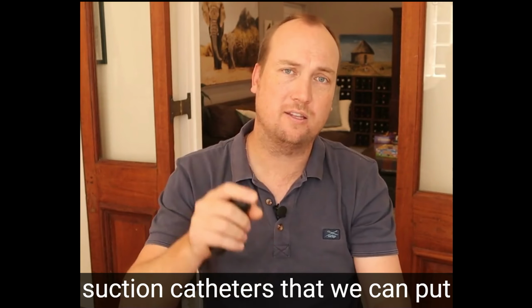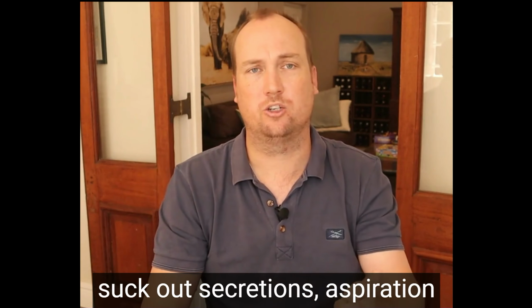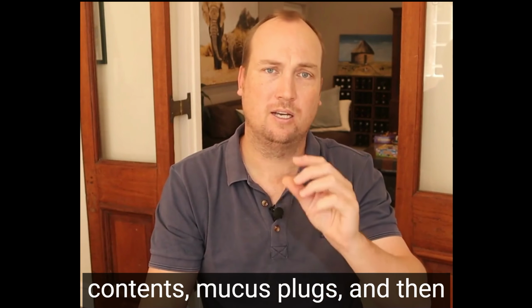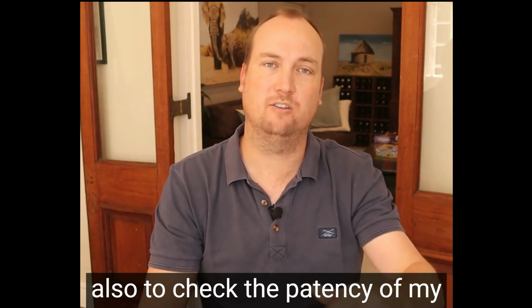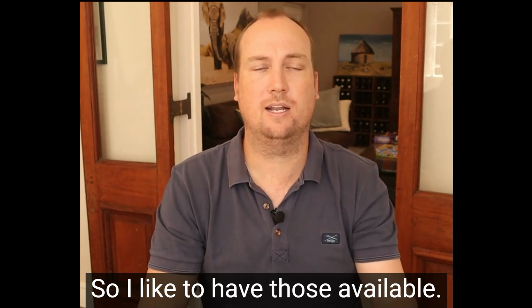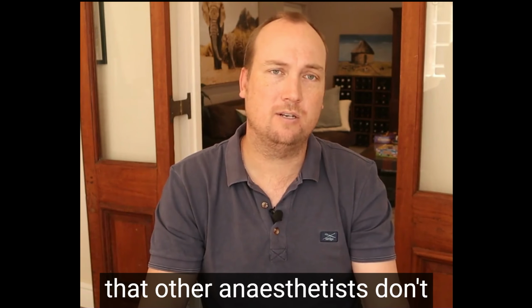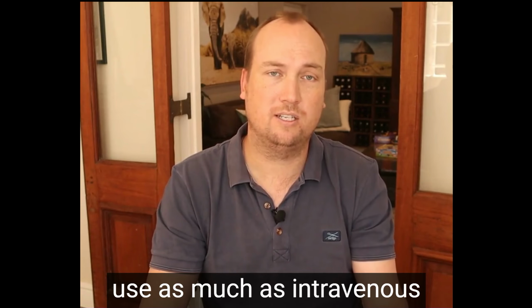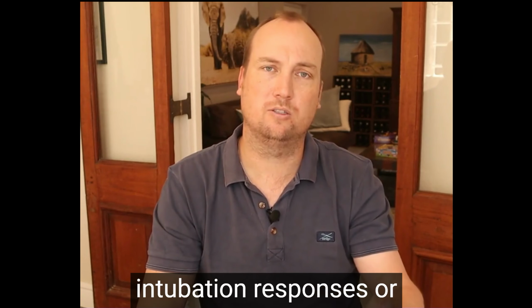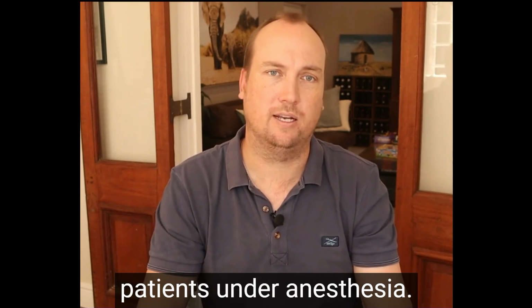The soft suction catheters that we can put down the endotracheal tube to suck out secretions, aspiration contents, mucus plugs, and then also to check the patency of my endotracheal tube that it hasn't kinked in the back of the throat. So I like to have those available. And then a drug that I might use that other anaesthetists don't use as much is intravenous magnesium sulfate to blunt intubation responses or to correct hypertension in patients under anesthesia.